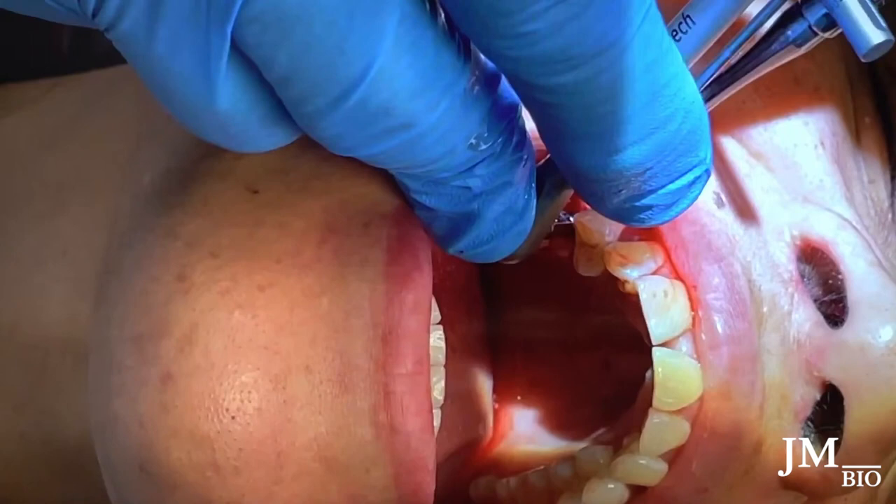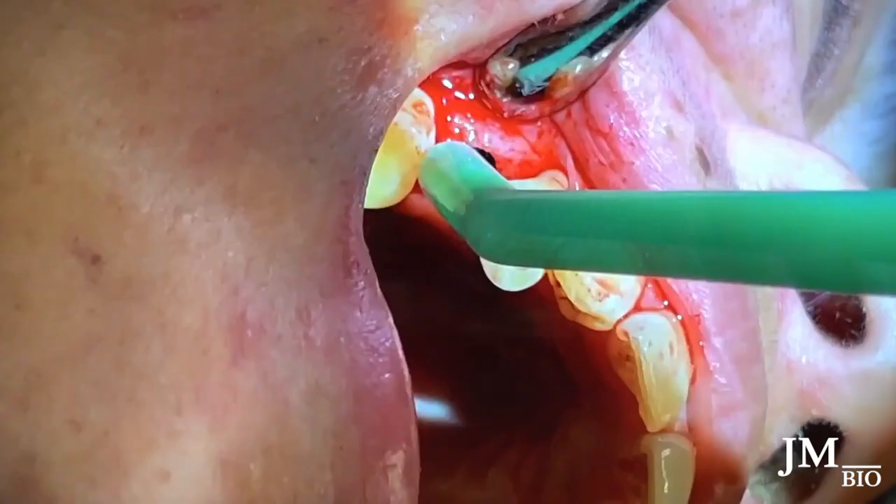Stability is pretty good. Am I over-torquing this implant? No, it's not that tight. On the upper jaw the bone is usually D2 to D3 — not D1. Over-torquing and compression necrosis is a concern when you get 100 to 120 Newton-centimeters on the lower jaw, especially with wide diameter implants. If it's that tight, you need to back it out, enlarge the osteotomy, and replace it. On the upper jaw it's very unlikely.